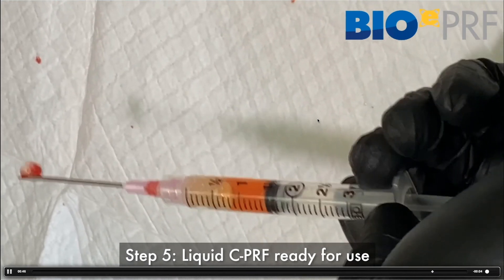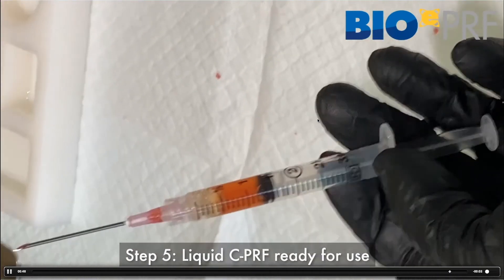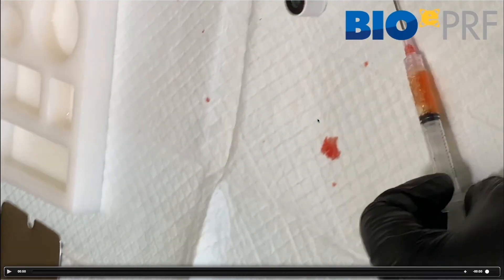So that's how that's done. You can see there, I got about 0.5 to 1 mL, somewhere around 1 mL roughly. That's typically what we're looking for when we draw the C-PRF.